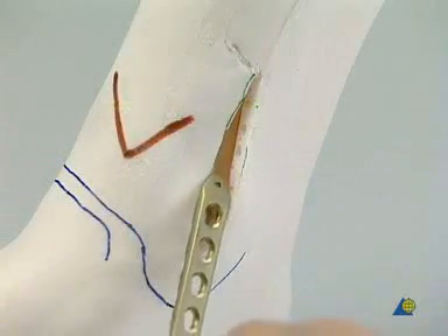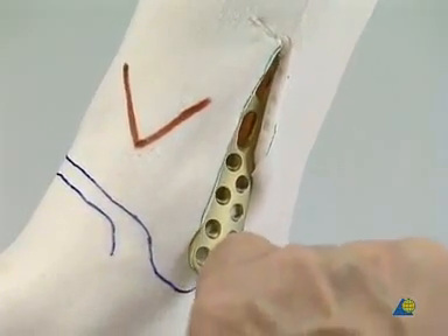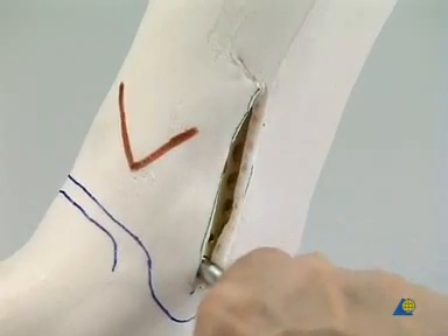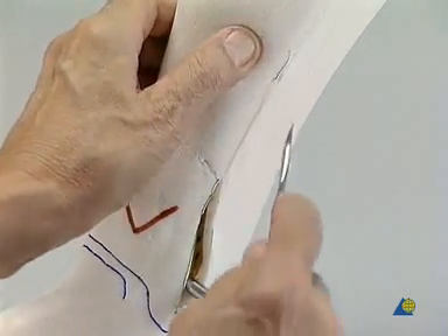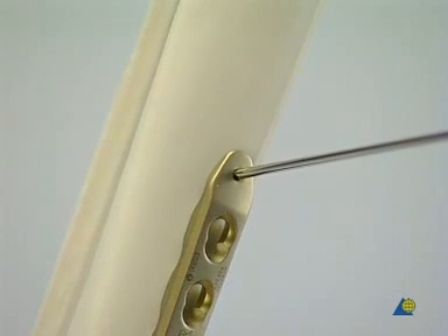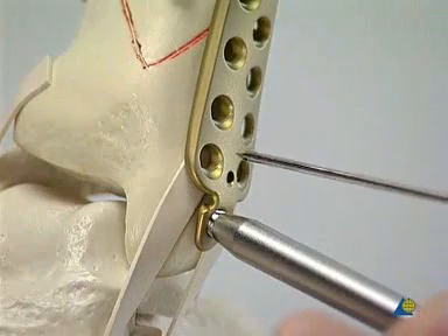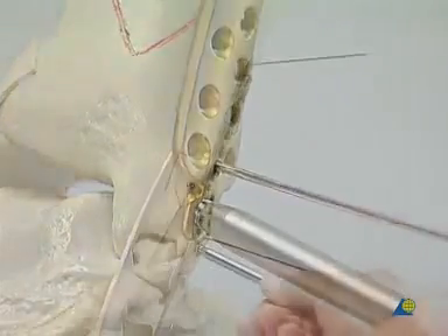With the bending pin screwed into the most distal plate hole as a handle, the slightly contoured LCP distal tibia plate is introduced and advanced proximally along the medial surface of the tibia between the periosteum and the subcutaneous tissue. An elevator can be used to prepare the route for very long plates. Palpation identifies the position of the proximal end of the plate, which is then exposed by a short incision. The final position of the plate is checked under image intensification just before K-wires are placed in the special holes at each end of the plate for preliminary fixation.